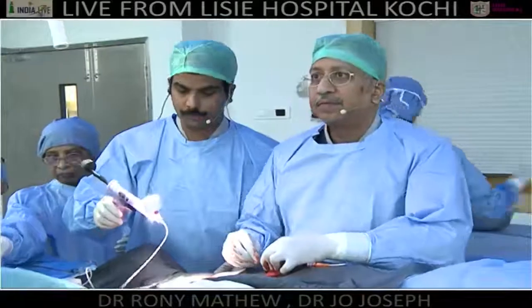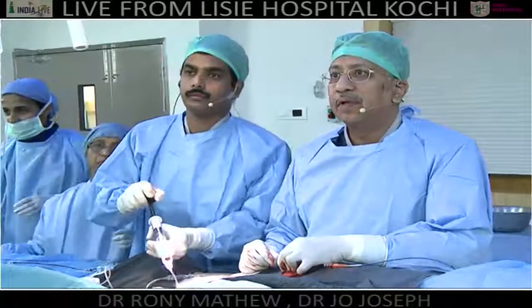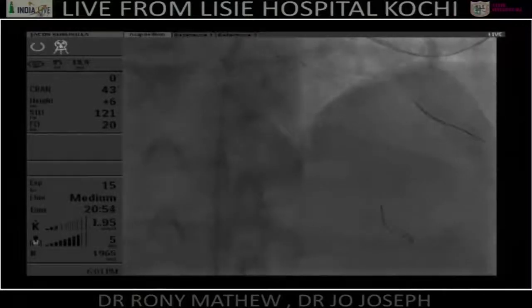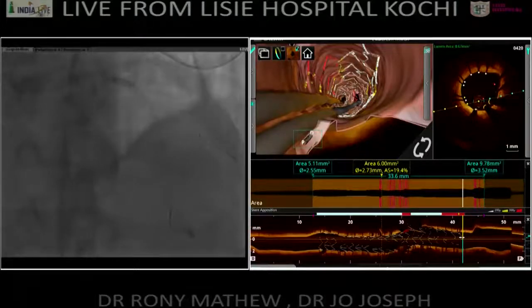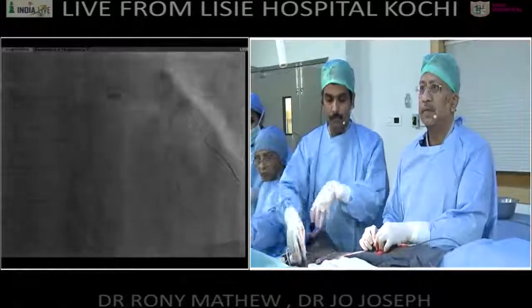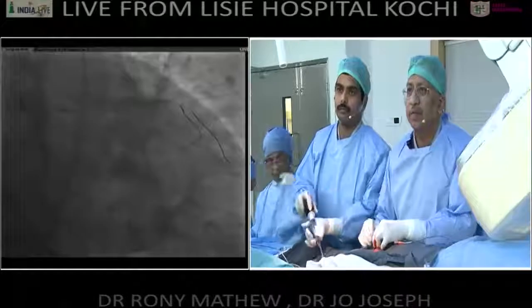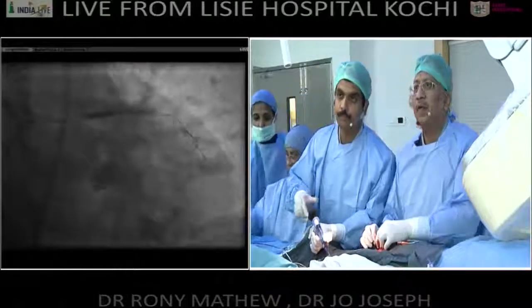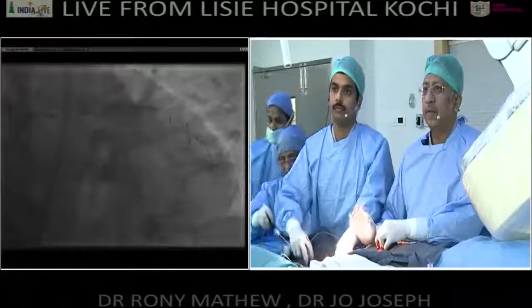Okay, go up. What size of balloon? 3.5, you have? And 3.5, yes. Short? 8, 12. 10, 12. 14, 16. Here, cardinal. Show me. Okay, that's it. Just go up. 12, 14. Down.